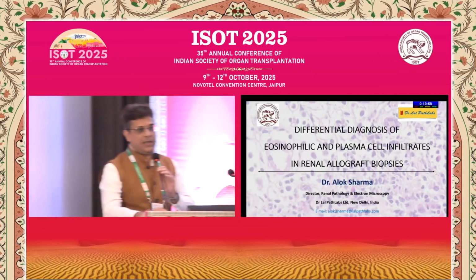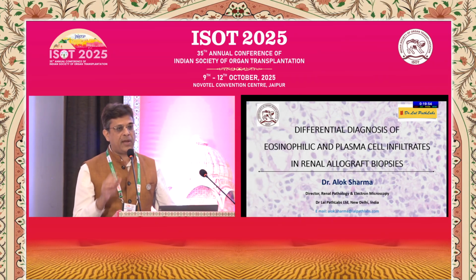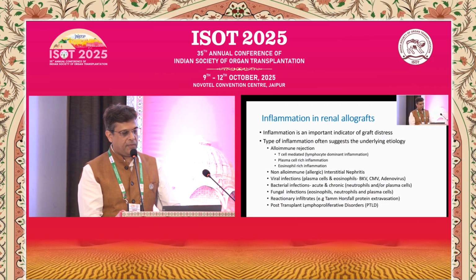I'll speak about, so I think it's an interesting session in the sense that we are learning about various infiltrates in the allograft biopsy and their relevance. So I'll take two of these and we'll quickly come to that.